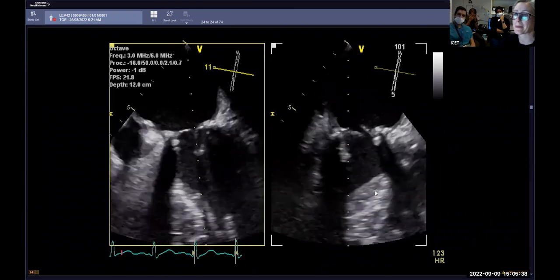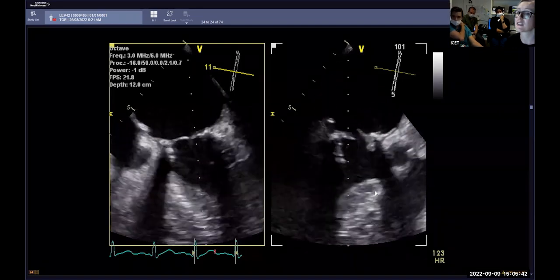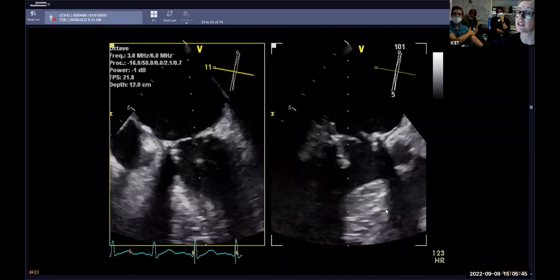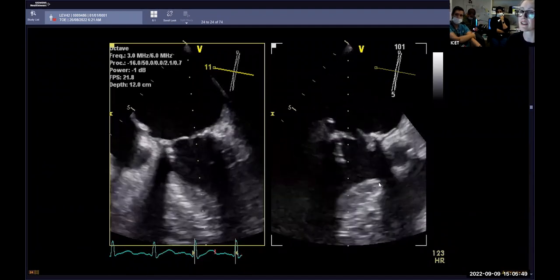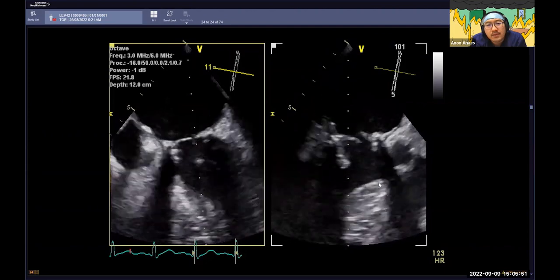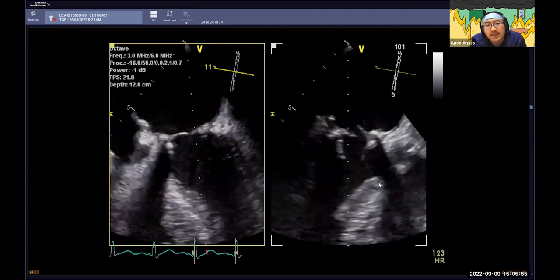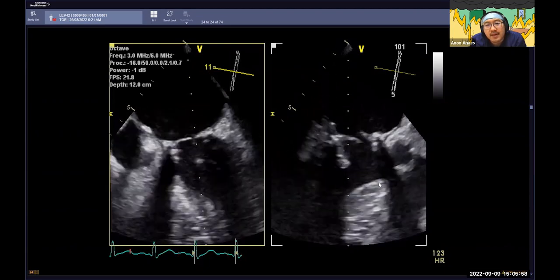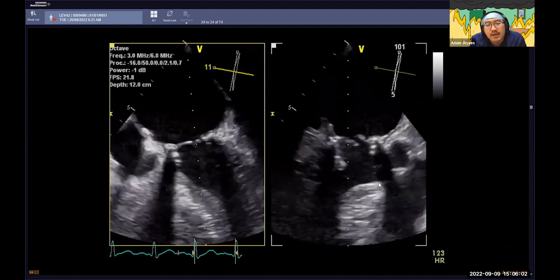All right. Guys, thank you very, very much for your time. Thank you. Any questions on that or anything to add to this, Jamal, actually, with your cardiothoracic experience? No, well, look, I mean, we talk about workflow of 3D echo for this kind of stuff. So if I was involved in this case, obviously the money's on this patient's bioprosthetic mitral valve. I presume there would have been some, that's where the money is.